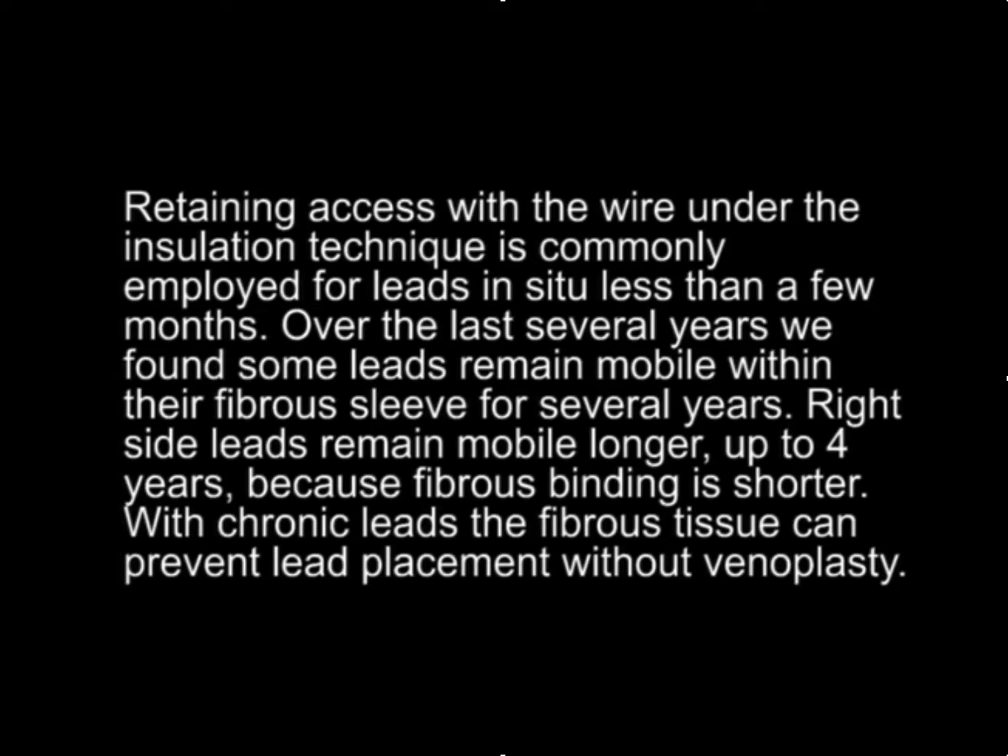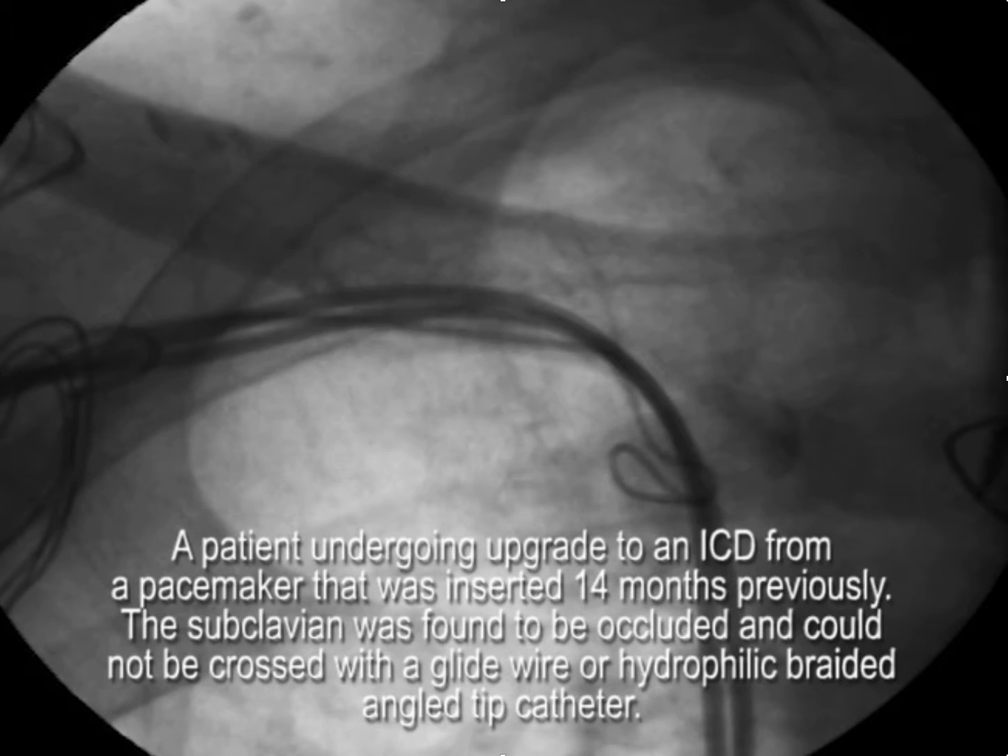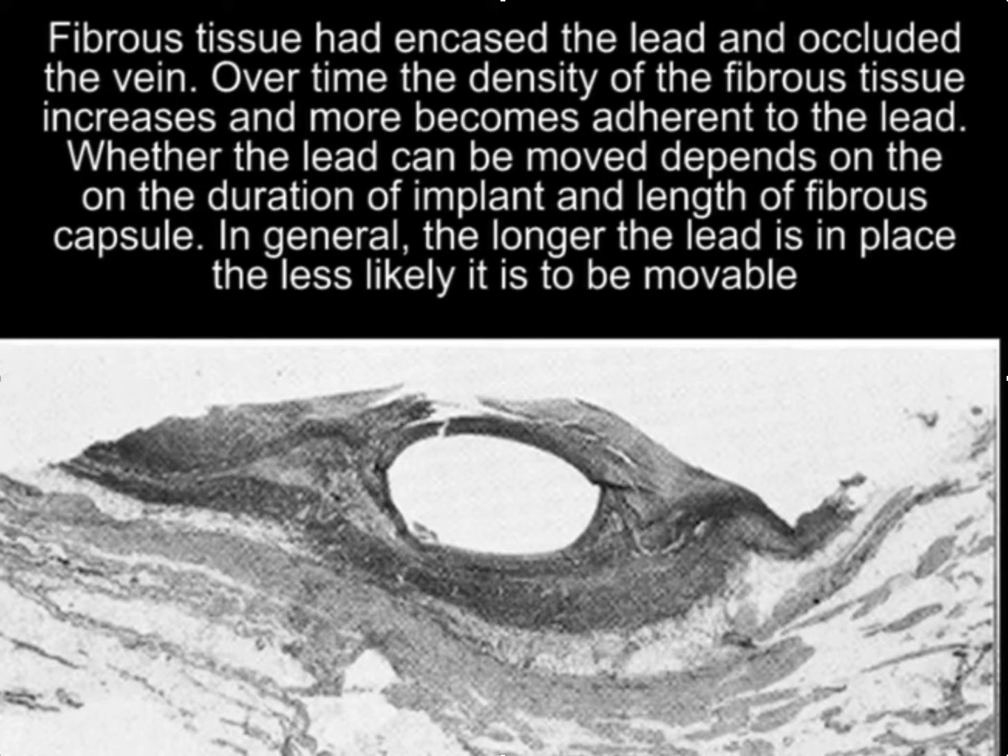With chronic leads, the fibrous tissue can prevent lead placement without venoplasty. For example, here's a patient undergoing an attempted upgrade and we could not cross the occlusion on the right side. The leads had been in for 18 months, and fibrous tissue had encased the lead and occluded the vein. Over time, the density of the fibrous tissue increases and becomes more adherent to the lead.